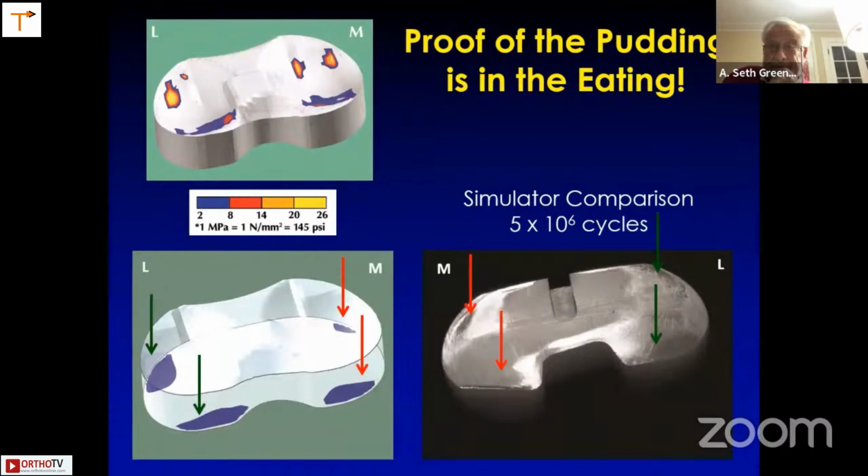An example of the consequence of poor fit between the femoral component and the proximal surface of a mobile bearing plateau, as predicted by its finite element model, is displayed. The poor proximal fit propagates to the distal interface, creating contact patterns along the edge. The amplifying effect of prescribed kinematics in a laboratory wear simulation specimen can be appreciated in this photograph from Walker of the distal surface of the same design. Comparison indicates that the finite element model is capable of accurately predicting locations of abrasion.